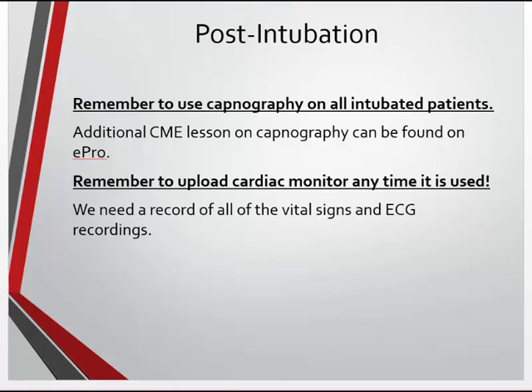Remember to upload your cardiac monitor. And again, if you have capnography on, the uploading of the monitor is going to let you verify that your tube was in place. So if you ever come into question on a QI situation or a lawsuit, that recording of your monitor is going to have the end-tidal CO2 readings on it, and it's going to let you know for sure that you were in. It's going to keep you from getting in trouble or from being blamed for not having a tube in place. So keep those things in mind. Right?